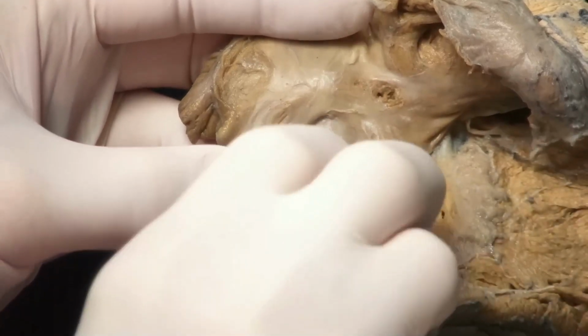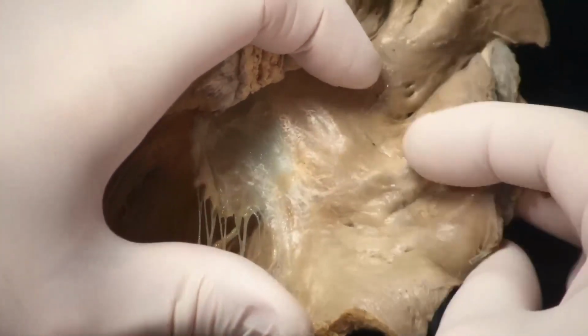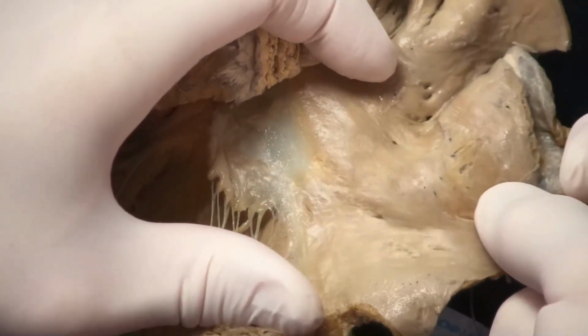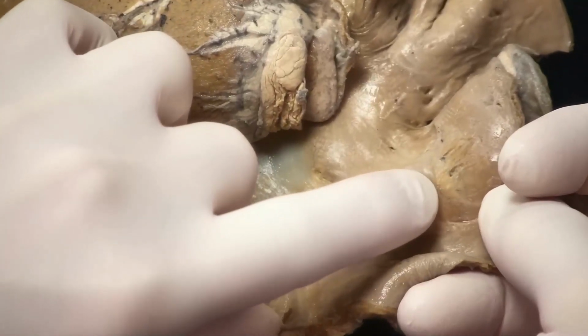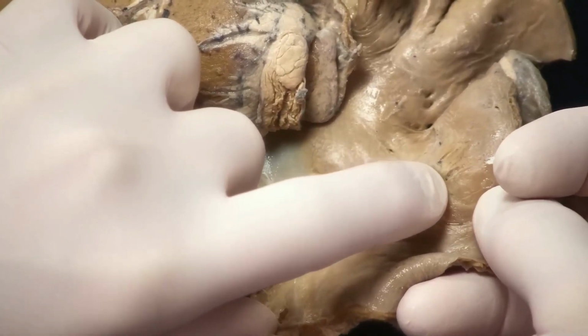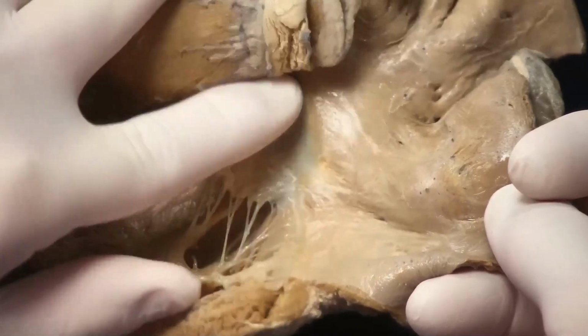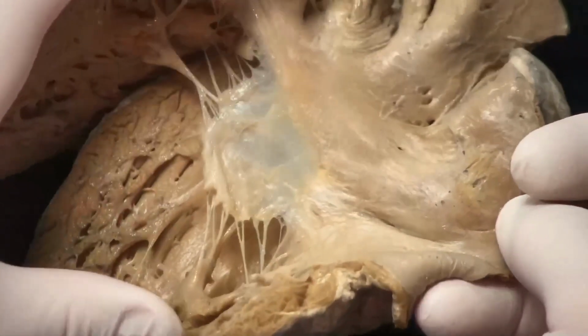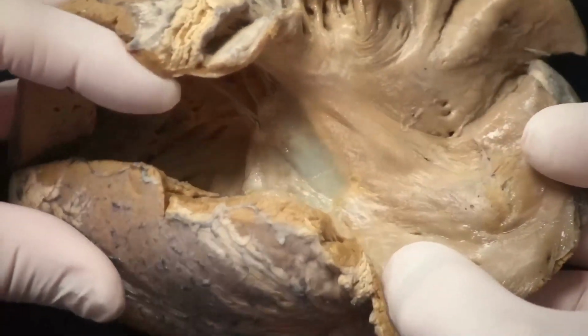So let's turn this heart over and look together from the left side of the septum. I'm going to put my finger in the oval fossa here, just to show you that position. And a posterior puncture, really where that small hole is, that posterior puncture is going to give you the greatest distance, therefore, to be able to access and align the clip appropriately with respect to the mitral orifice.